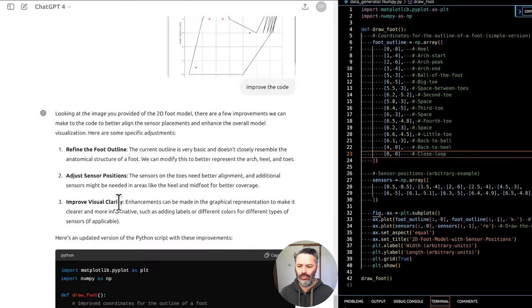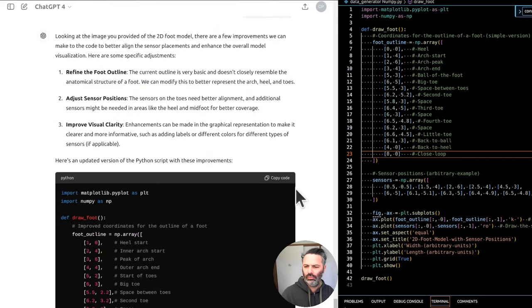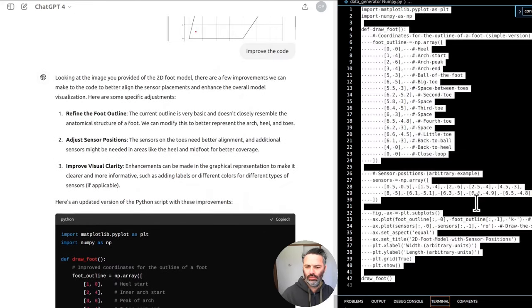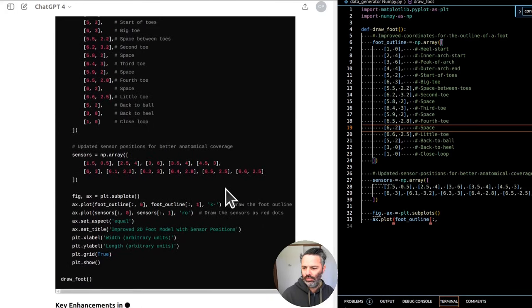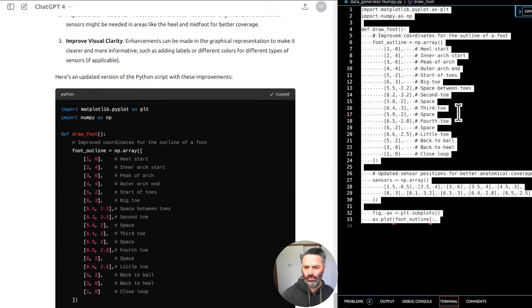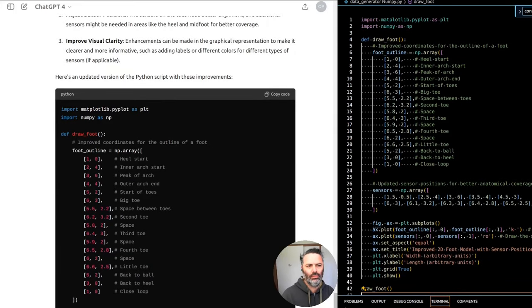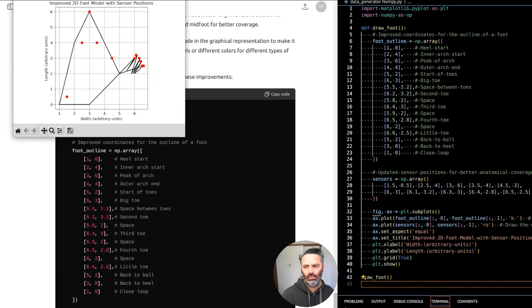To create a simple 2D foot model for visualizing sensor positions, you can follow these steps to design it using basic graphical elements. This can be done using a graphics library in a programming language like Python, or even with vector graphics software. Here, I'll guide you through generating a 2D foot model programmatically using Python and the Matplotlib library. Steps to create a 2D foot model.